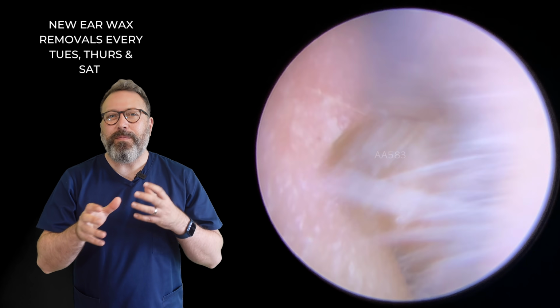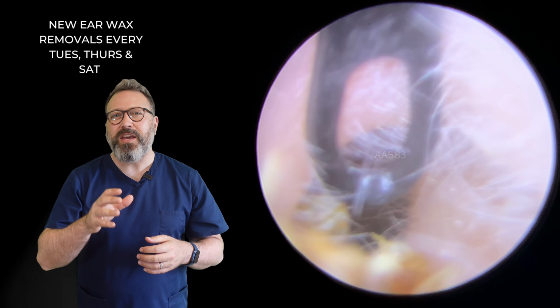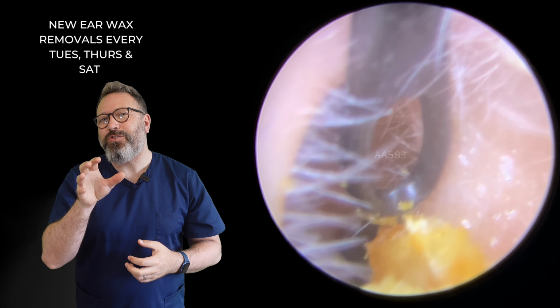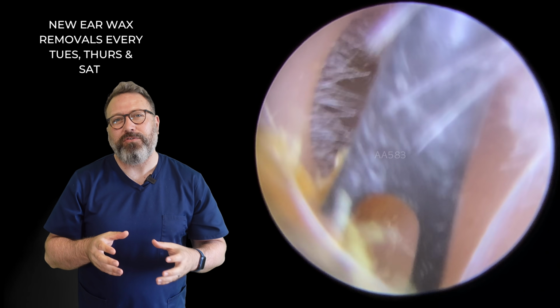Now, when we get a patient come through with tinnitus, we always check for wax first of all. You can see we've got this hard little bit of wax and again, this dry piece of skin sitting behind. But that's not really the issue. We had a nice big gap down the one side, so the sound can get through really easily.